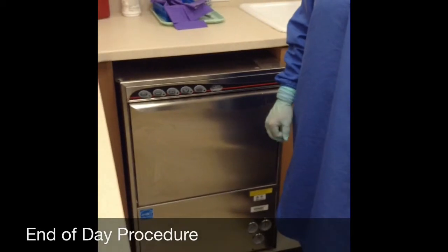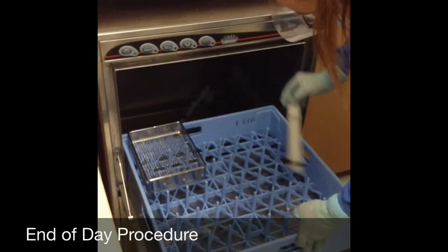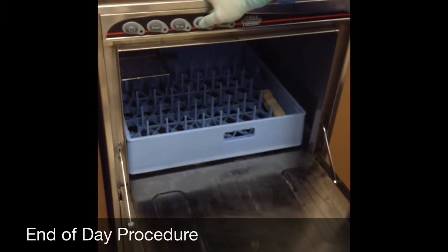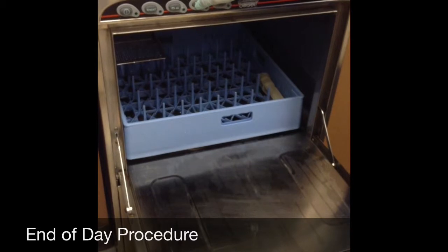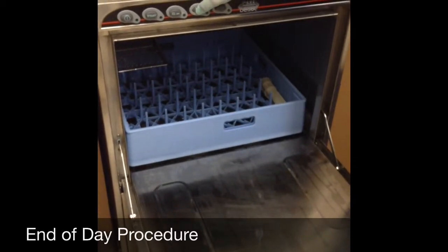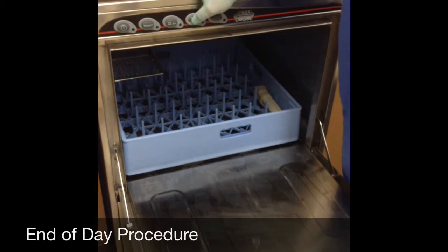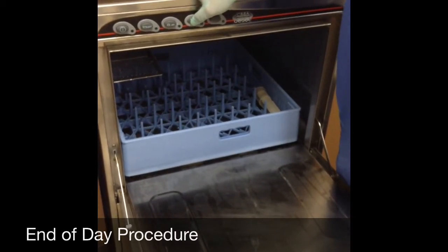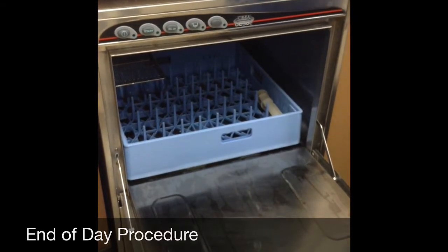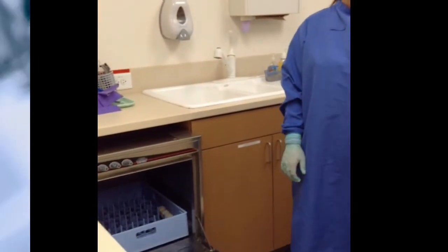Now we are ready to show the end of day procedure. We are going to drain the instrument washer. We need to pull the plug out of the bottom of the washer and lay it in the blue tray. We need to turn off the washer and then press and hold the second button from the right. We can hear it draining right now — we are listening for a swoosh to let you know that it is done draining. Now that we heard the swoosh, the instrument washer is drained. We leave the washer open at the end of the day.